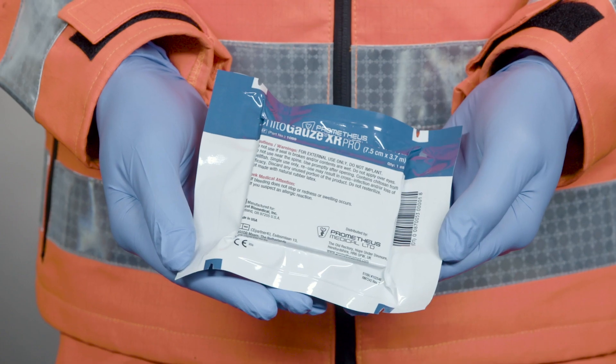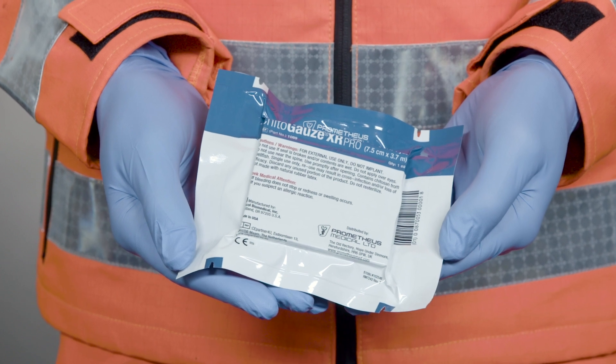I'm Dr. Richard Lyon and in this video I'm going to demonstrate how to use the Prometheus ChitaGauze XR Pro. This is a hemostatic dressing for the temporary control of severely bleeding wounds.